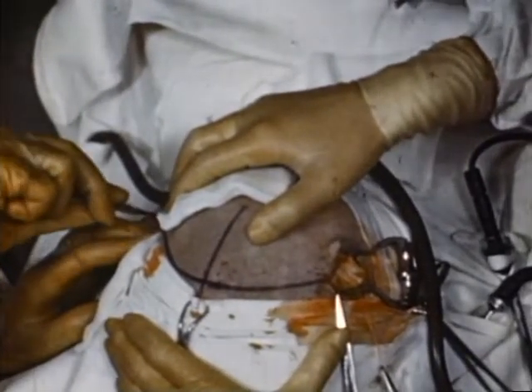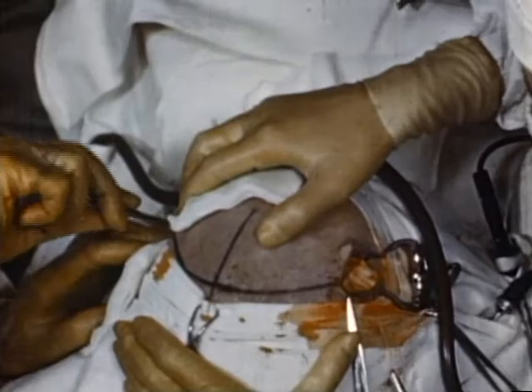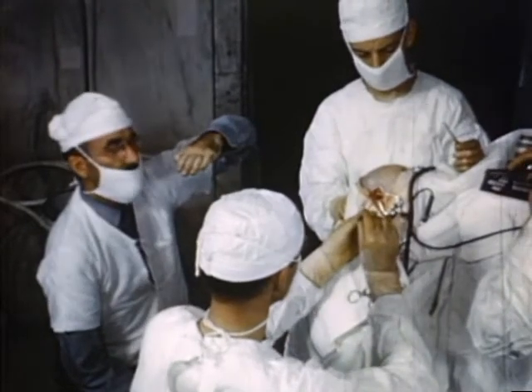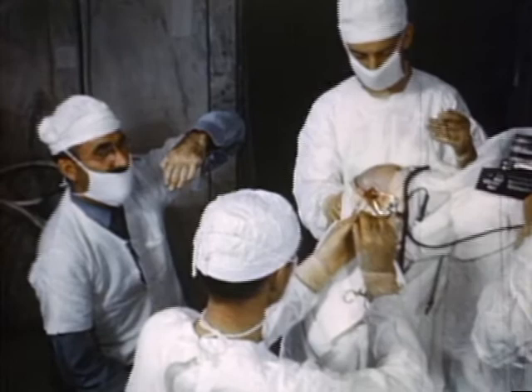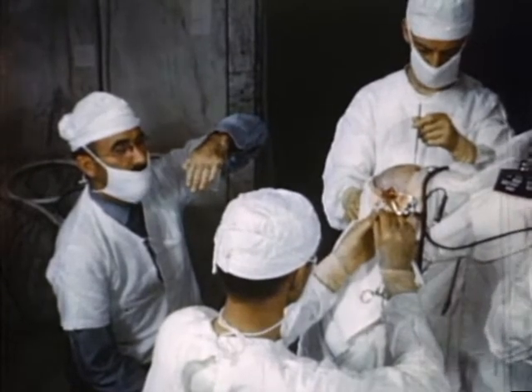A similar opening is then made on the opposite side. In the following procedure, the surgeon inserts the leucotome into the brain. He is guided by the neurologist in order to keep the brain incision constantly in the plane of the coronal suture. His first move is to penetrate directly through the brain from one opening in the skull to the other.